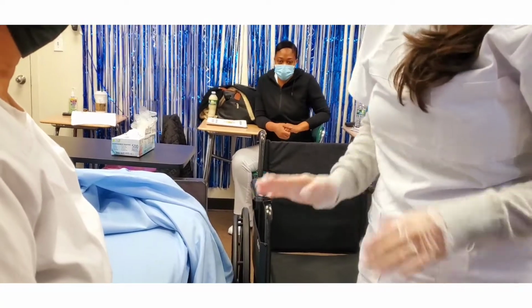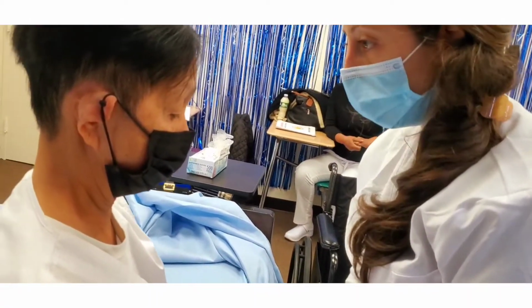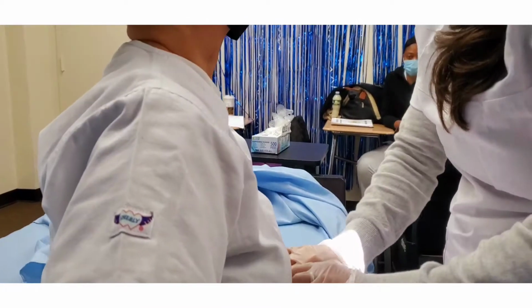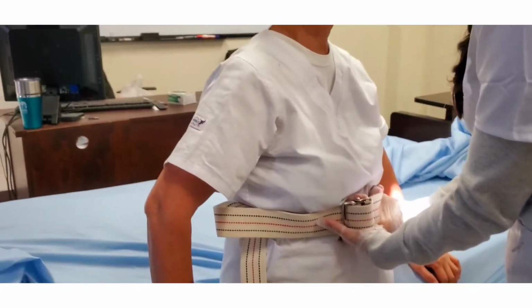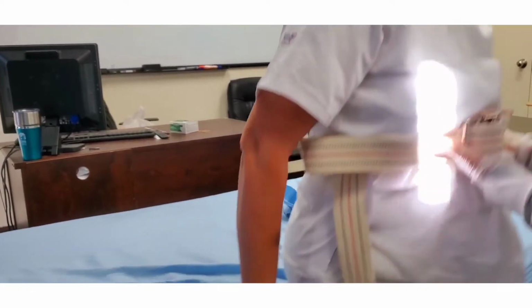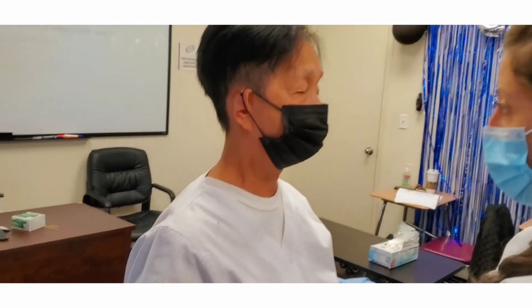Okay, now Miss Carpio, I'm going to put my knees on your knees. Good. And I'm going to ask you to put your arms on the bed. And I'm going to take your gait belt and put my fingers up on it. Okay. And slowly on a count of three, I'm going to raise you up, okay? One, two, three. Okay, any dizziness? How do you feel? Okay, no. You're okay? Okay.